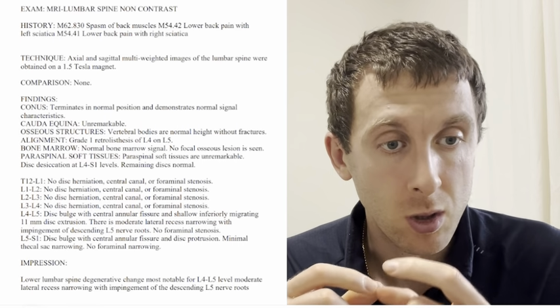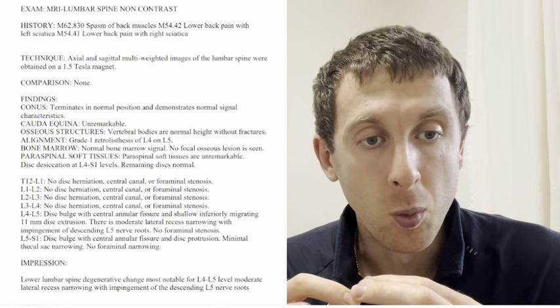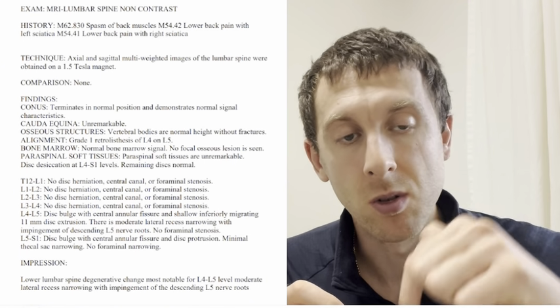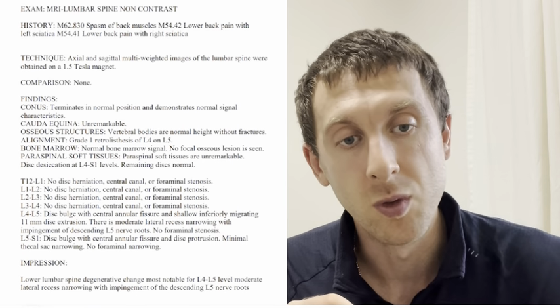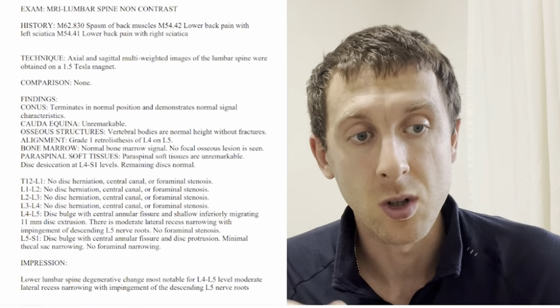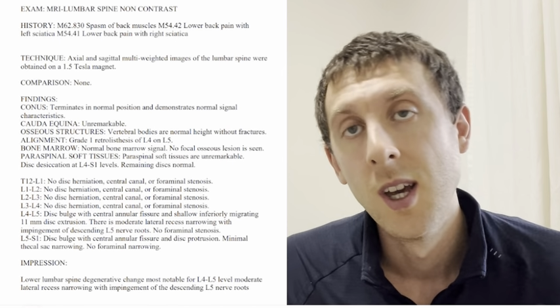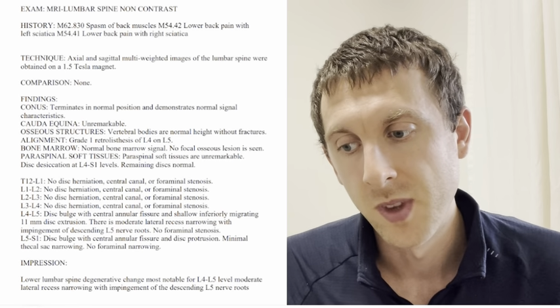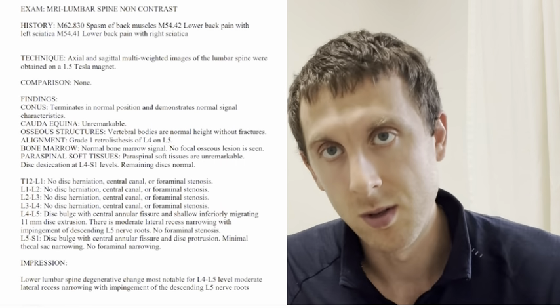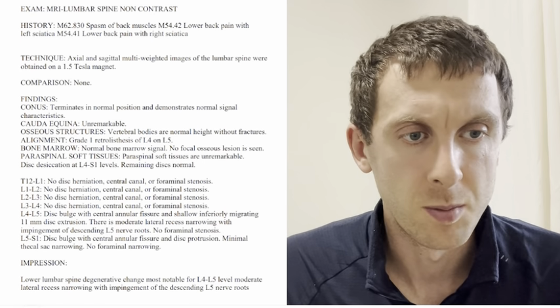So there's an injury to those annulus fibrosus fibers, which has resulted in a shallow, inferiorly migrating component of the disc. So the disc is moving downwards, and subsequently it's called a disc extrusion. So an 11 millimeter disc extrusion. A disc extrusion is basically a type of disc herniation where the contents of the disc have now moved downwards to irritate the nerves as they're traveling in your spine.